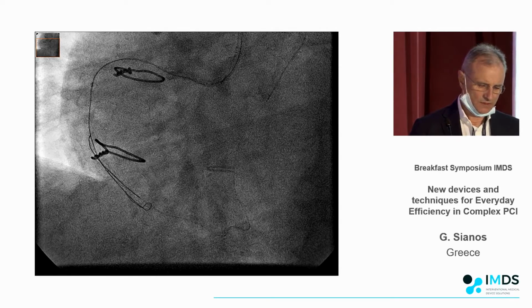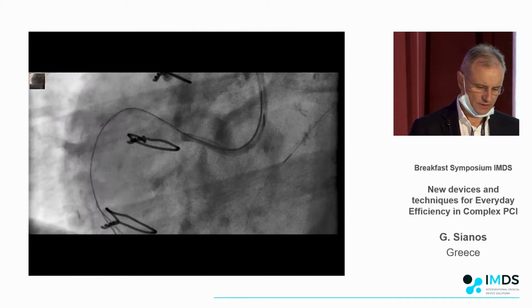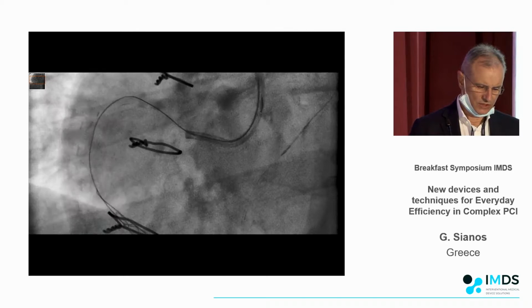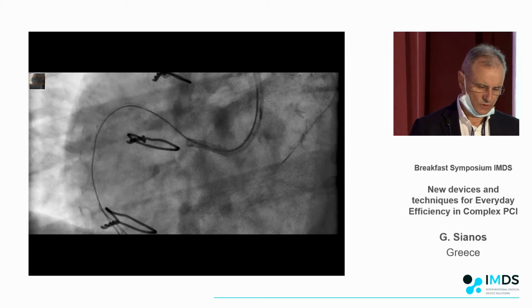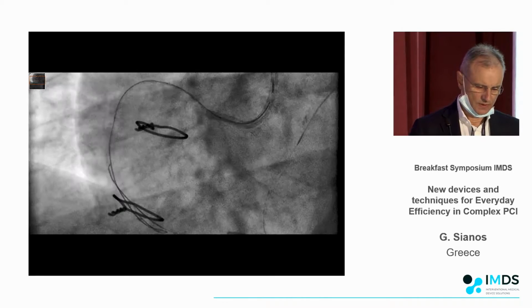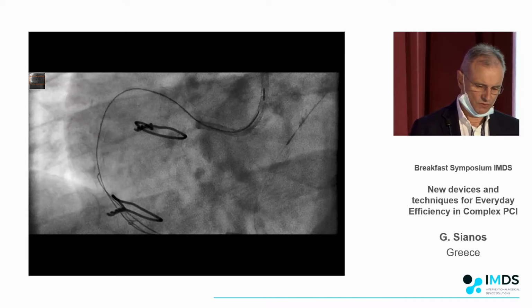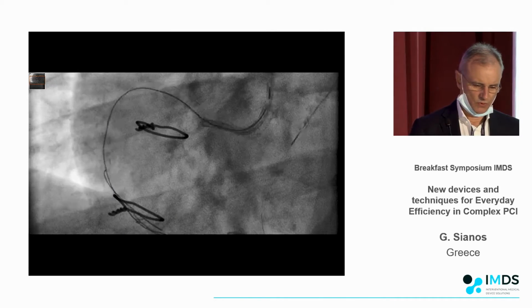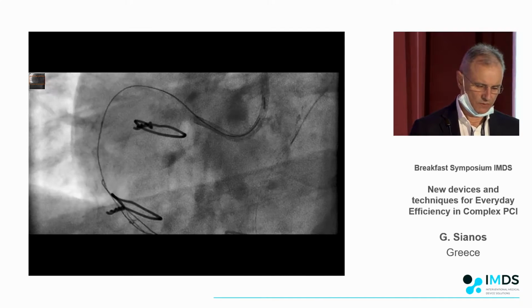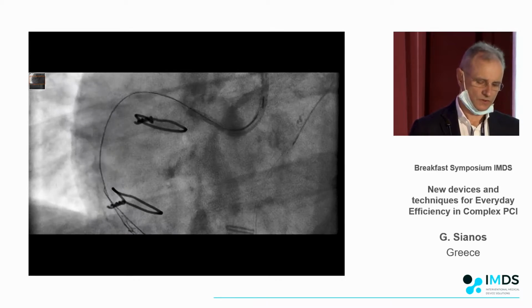The conventional device here failed to cross, and then the Blimp is coming; here it is, you can appreciate it. We're pushing, there is lateral deflection, and then we raise the pressure, not increasing it further. We keep it up to the level that it has to be kept. With complete alignment, we keep the pressure on the device, you have to wait for it, keeping it aligned with the guide wire, and then suddenly you see that it propagates within the occlusion.